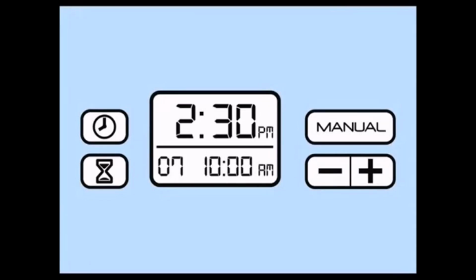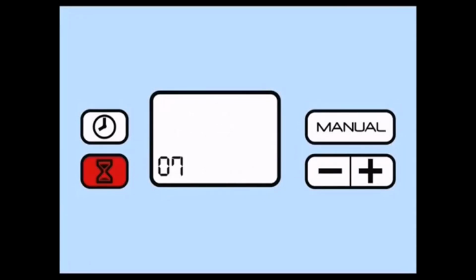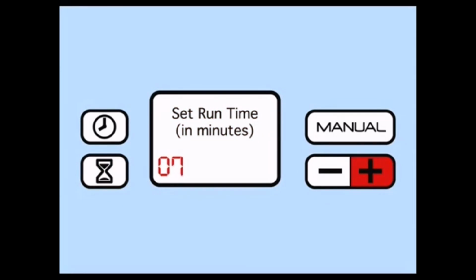You can do this by pushing the hourglass button. You'll then be prompted to set the run time, that is, how many minutes the SoClean operates during its daily cycle. Increase or decrease these minutes by pushing the plus or minus buttons. 5 to 10 minutes should be enough to completely sanitize your equipment.